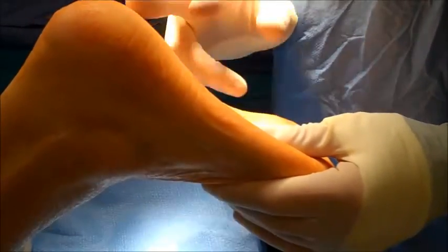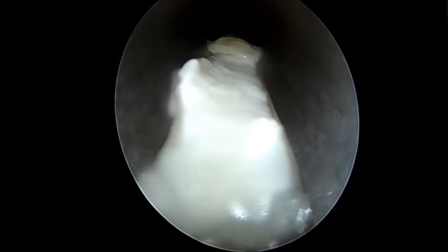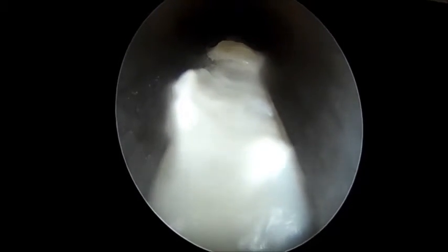What we're looking at here is the plantar fascial band. We've gone just superficial to it and what we'll be doing is releasing that tissue. When we cut that band, you'll actually see the deep muscles underneath.